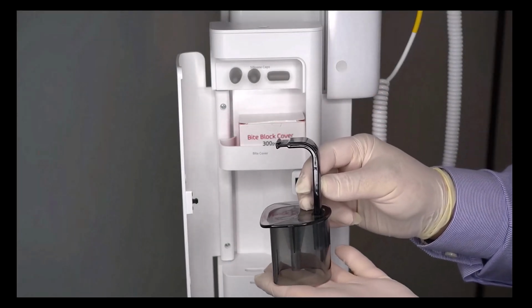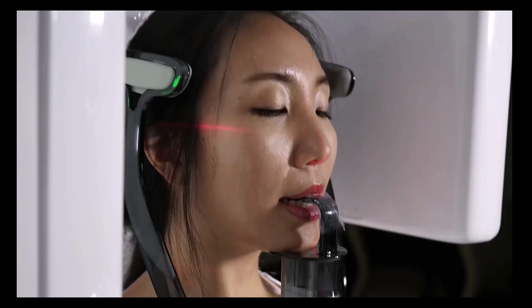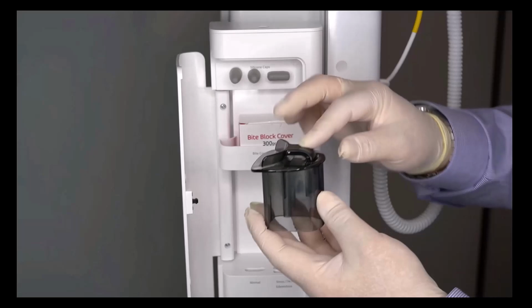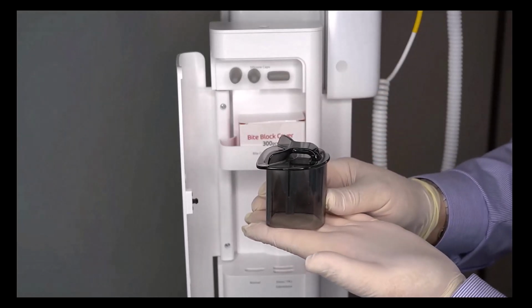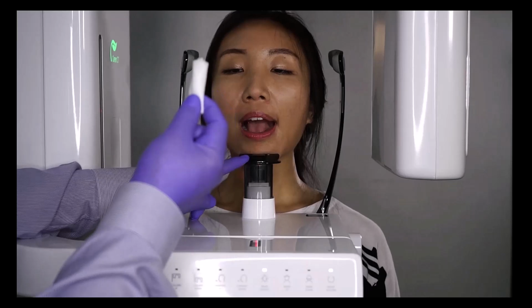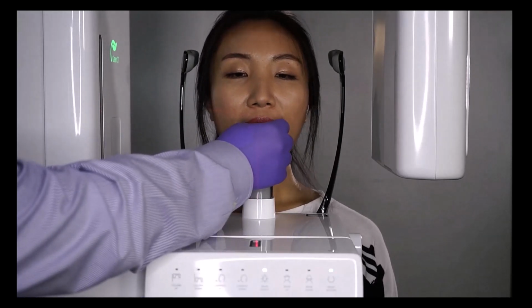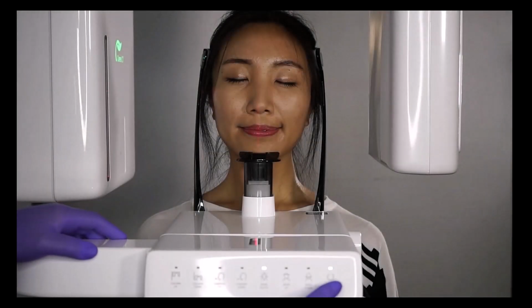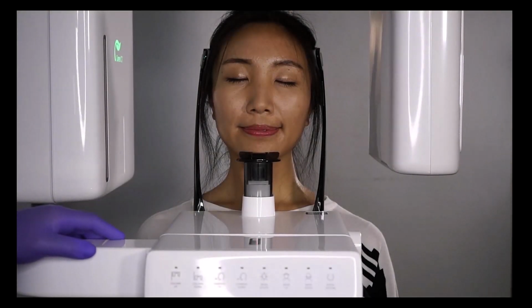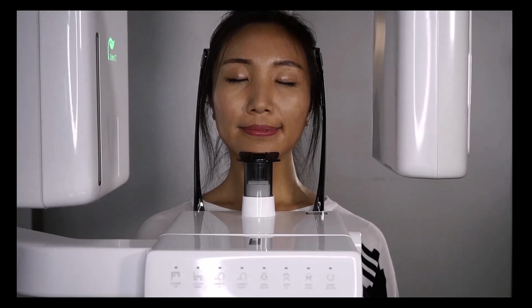Chin rest with normal bite stick. Special bite B or edentulous rest. Use a cotton roll to separate the bite. This method may also be used if the clinical need requires the patient to be in centric occlusion, having the patient resting with the chin cup with the bite at rest.